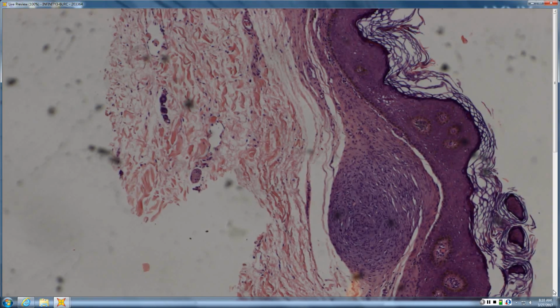And going away from this tumor, if you have a desmoplastic melanoma, and you want to know if it's perineural involvement or not, you get two immunostains. You get either an S100 or SOX10 paired with an EMA. Normal nerve, the nerve itself will be strongly S100 positive. The perineurium will be an S100 negative perineurial sheath. If that perineurial sheath is S100 positive, you're looking at desmoplastic melanoma.